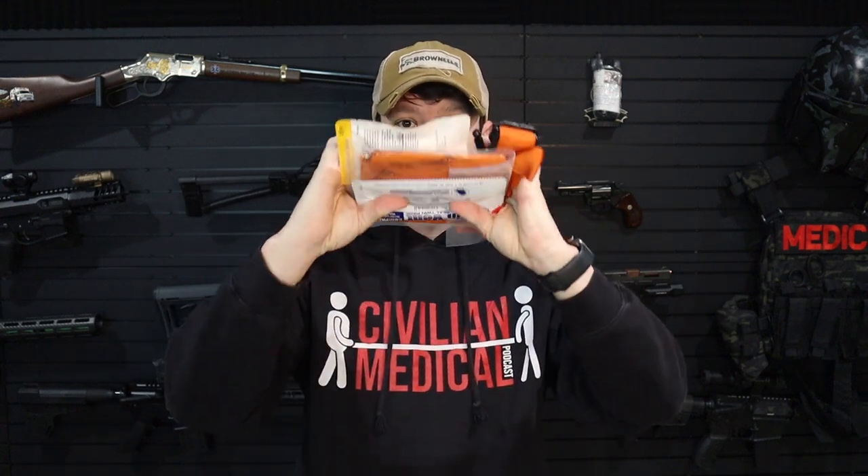So here we have a tourniquet. We did the EMS roll gauze because it's nice and compact. We already have compressed gauze in the Mini 2X. We have a pressure bandage. We didn't put an NPA in this one, but you could easily log roll someone and that's going to help protect their airway. For respiratory, we did the compact chest seals — we get two of those. And then we have a Blizzard survival blanket.